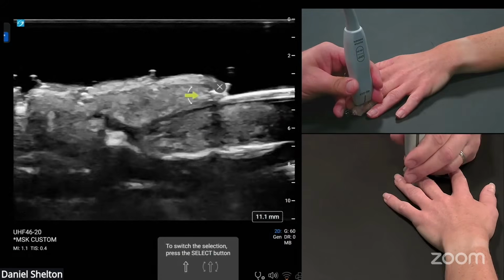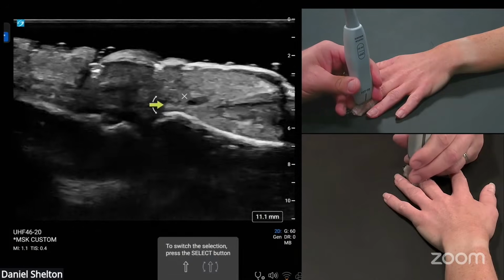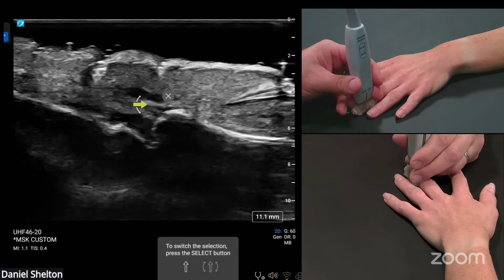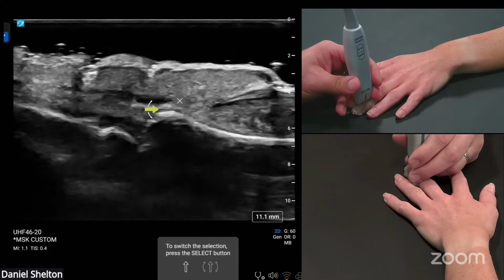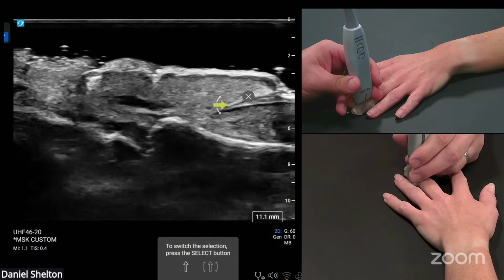Okay, and that's called the nail halter. That's that section of ligaments that goes around and wraps almost like an extensor hood and attaches this set of fibers to the extensor tendon here. So we've got this really, really fine ligament layer jumping from the extensor tendon over to this nail root.